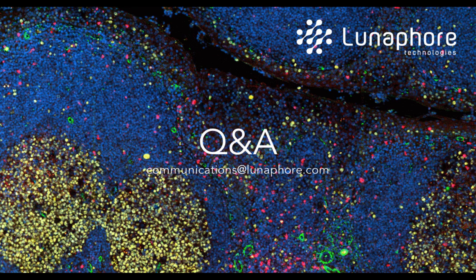The first question that we have is, can we use any desirable marker? Is the platform open? Any requisites for antibodies? That's a very interesting question. So yes, the platform is open, so we can use any marker of interest. There is no particular requirement, neither from the point of view of barcoding or whatsoever. The only specification that we need is that the fluorophores that we use in conjugation with the secondary antibodies have the right match in terms of emission and excitation spectrum.